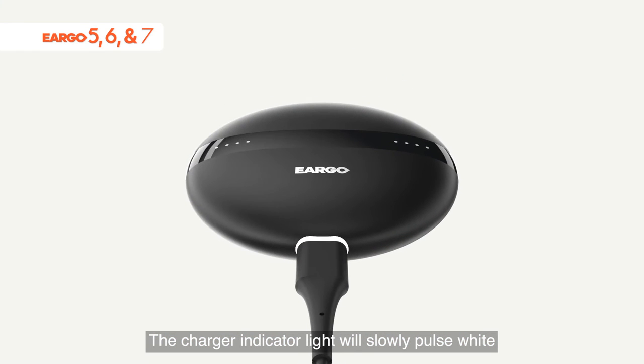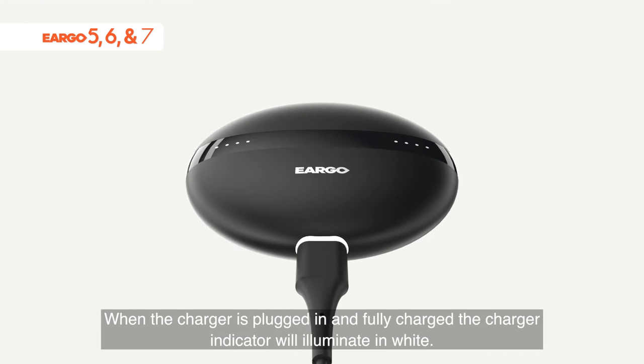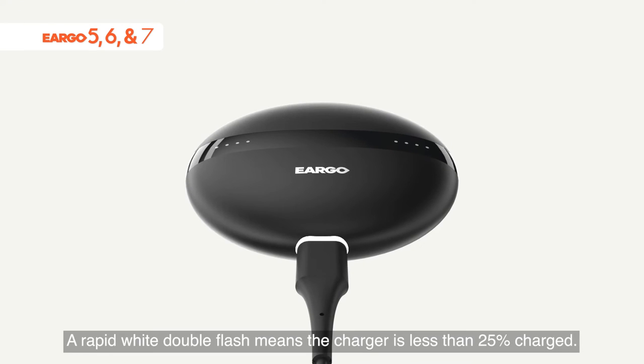The charger indicator light will slowly pulse white when the charger is plugged in and actively charging. When the charger is plugged in and fully charged, the charger indicator will illuminate in white. A rapid white double flash means the charger is less than 25% charged.